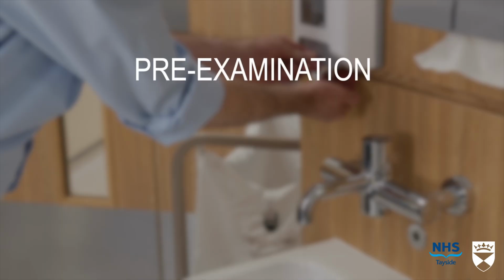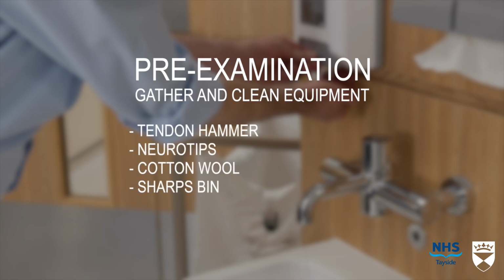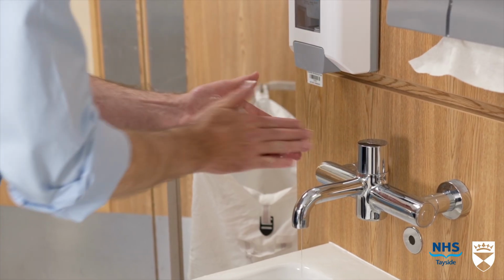Gather and clean required examination equipment. You will need a tendon hammer, neurotips, cotton wool, sharps bin, and a 128 Hz tuning fork. Perform hand hygiene.